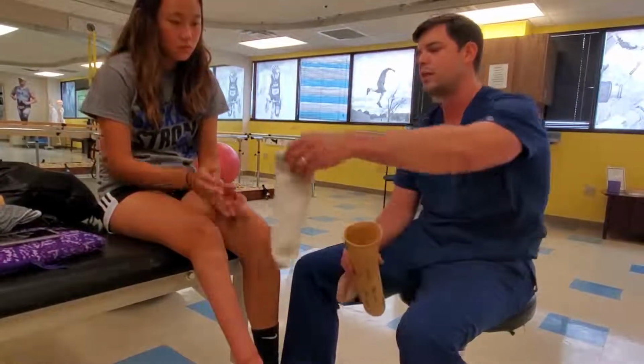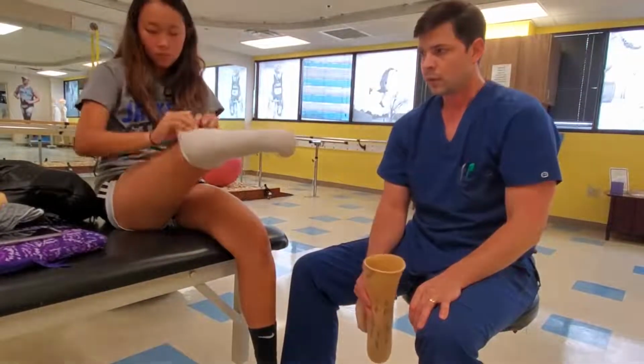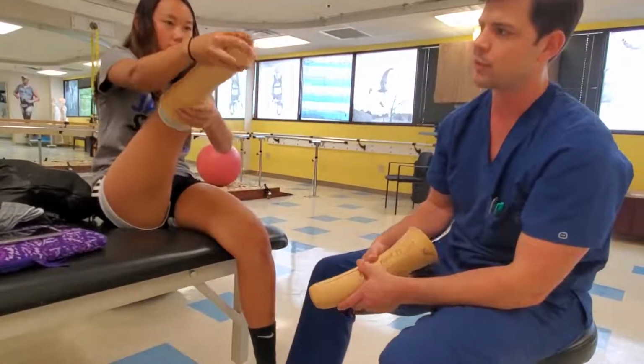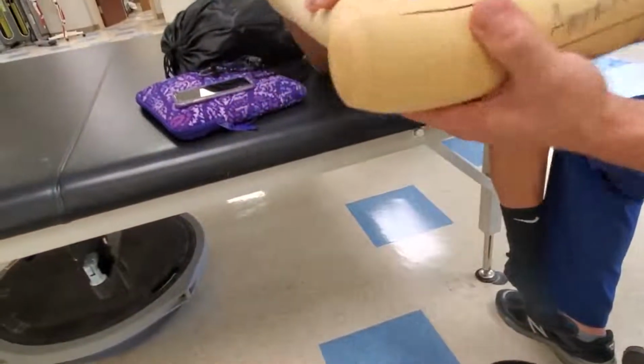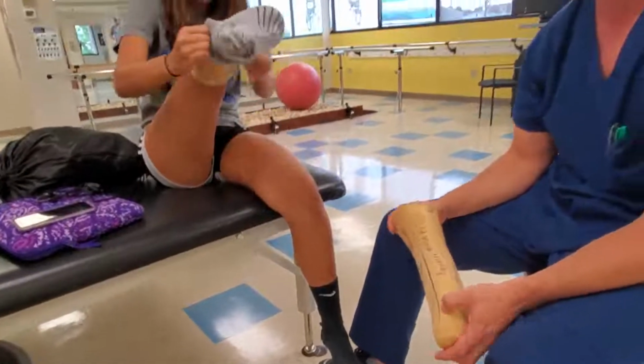So this is how she puts her leg on. She's just going to throw this sock on her leg. And then we have this P-light. What we did differently on the P-light compared to this one is normally we slit them, but we found when you punch holes where the slit ends, it prevents them from running down the P-light, so we try to do that just to make them last a little bit longer.